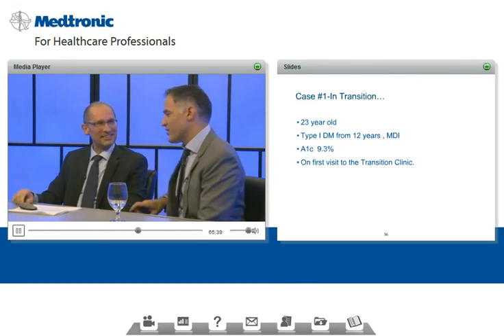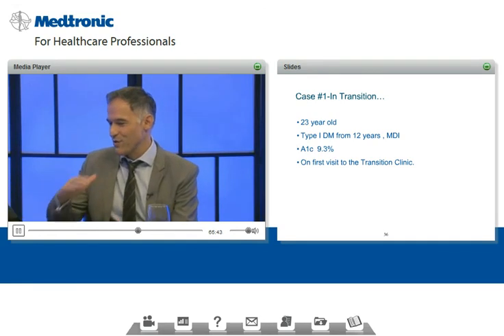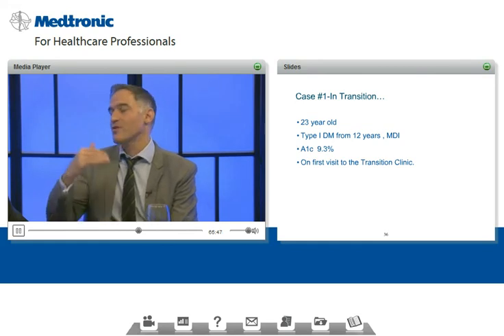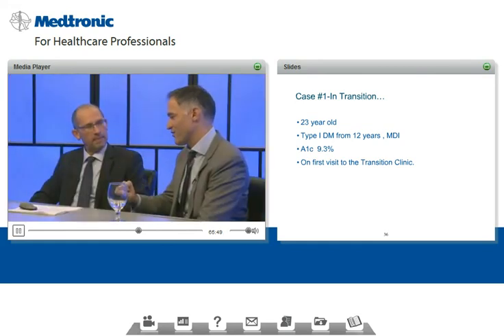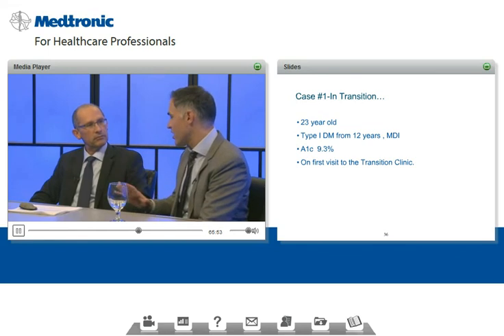Yeah, actually, if I can, I'll take 10 more seconds. For that patient that was getting lows after boluses in the afternoon, you can decrease their carb ratio, or I'm sorry, increase their carb ratio so that you decrease their food bolus. But as they leave the clinic, you may say, listen, I made that change. You're going to be protected from that kind of hypoglycemic event a little bit better, but that's a time of day where we need to understand better.